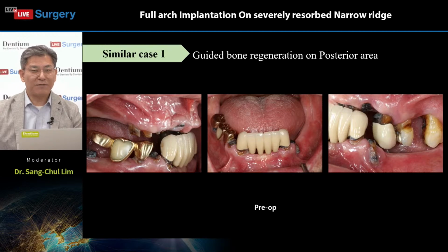So after implantation, at the prosthetic stage, it is very difficult to get the proper vertical dimension, so we need more information.